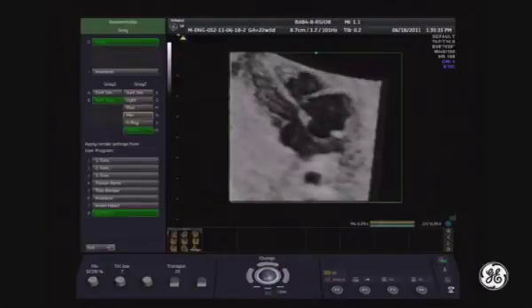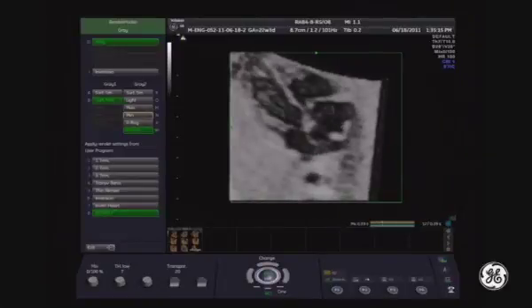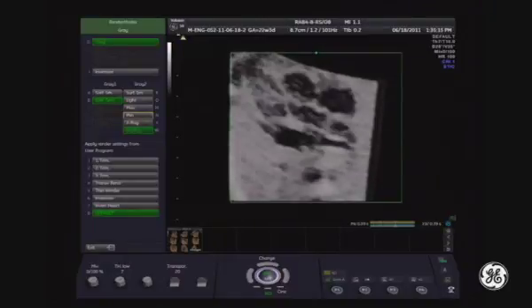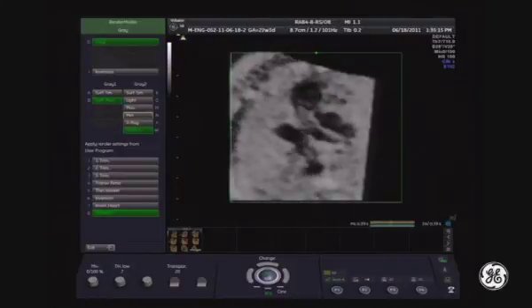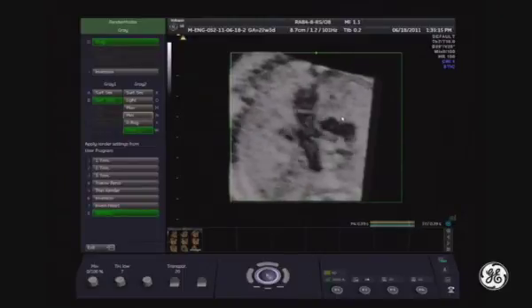So let's try to move this region of interest across the cardiac views. I will move it towards the ascending aorta. And you can see with this deeper perspective the ascending aorta. And you need to wait a bit again. Next, you can move to the right outflow. And with the deeper perspective, you can see the valve of the pulmonary artery very clearly. So this is the potential of rendering.